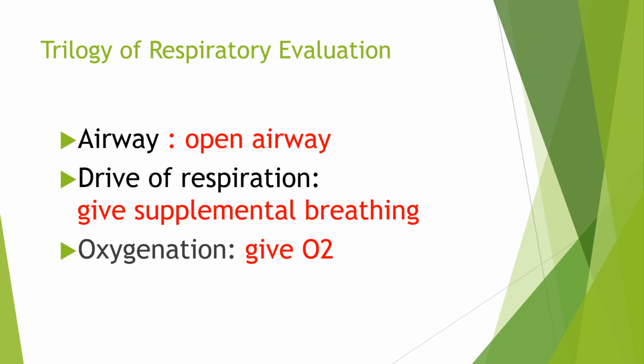If the airway is secured but the patient is still cyanotic or breathing with effort, we evaluate the drive of respiration. If the patient is in imminent respiratory failure or has insufficient respiratory drive, we give supplemental breathing using the bag valve mask.